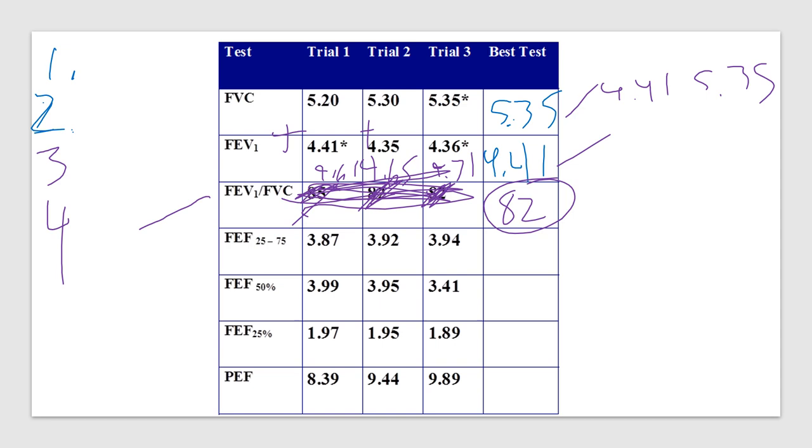And final step four, which is where you sum, and I did it a little earlier, sum up these two, the FEV1 and FVC. Whichever one has the highest values, then we're going to bring those values on over. So we determined that the 9.71 was the largest value. So that means the flow rates, all these flow rates here, all we're going to do is just copy them over.